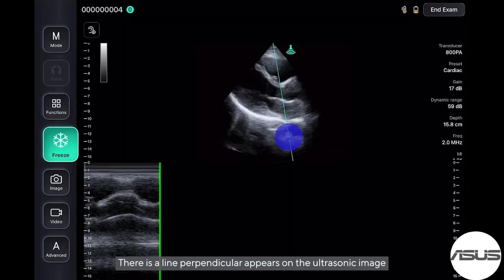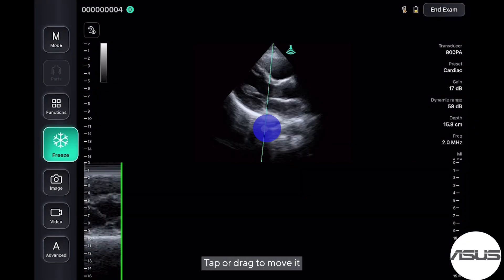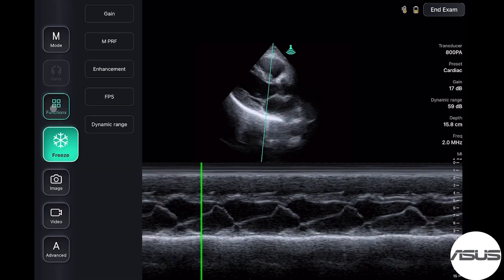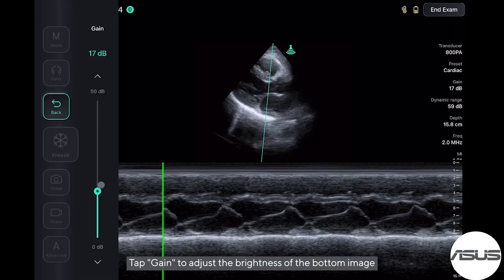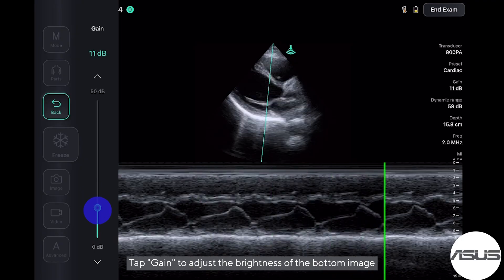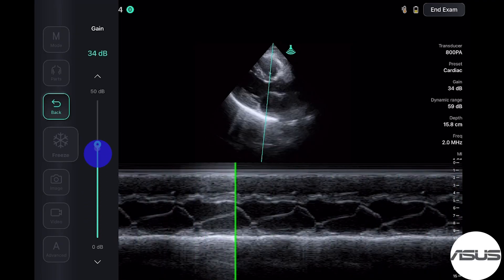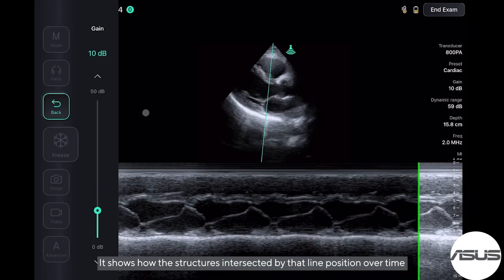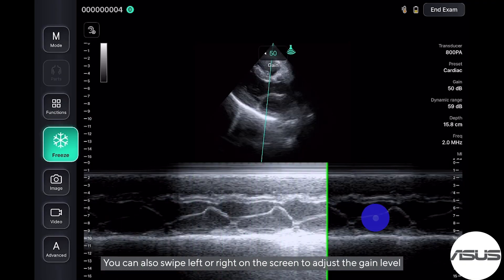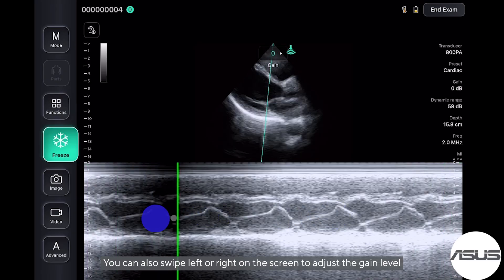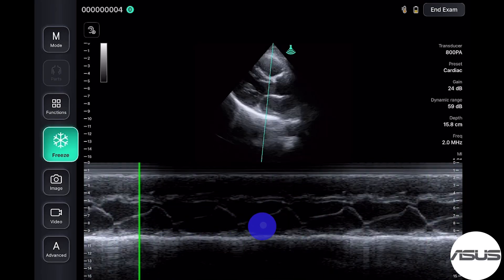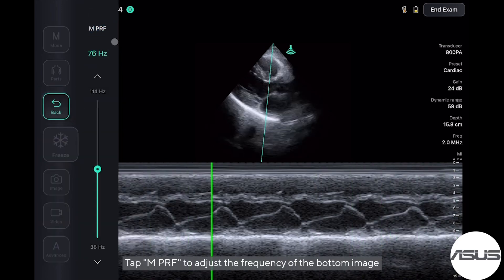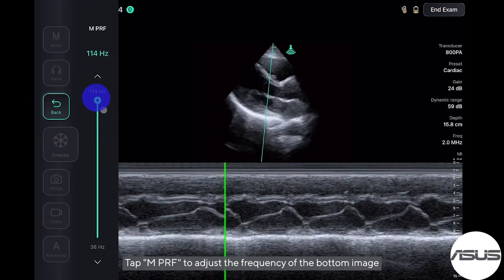There is a line perpendicular that appears on the ultrasonic image — tap or drag to move it. Tap gain on the left side to adjust the brightness of the bottom image. It shows how the structures intersected by that line are positioned over time. You can also swipe left or right on the screen to adjust the gain level.